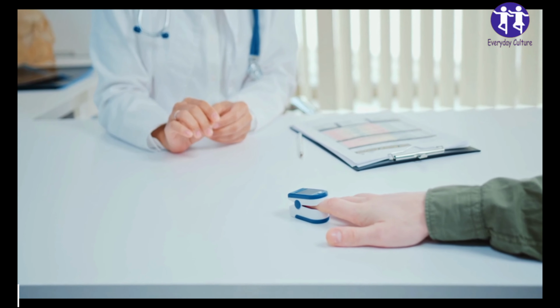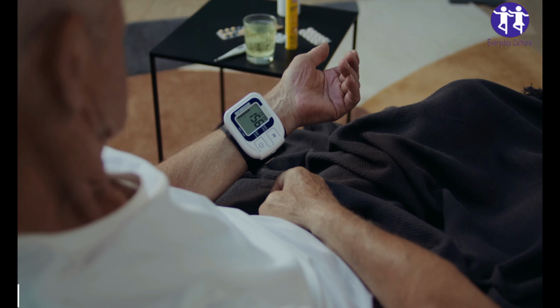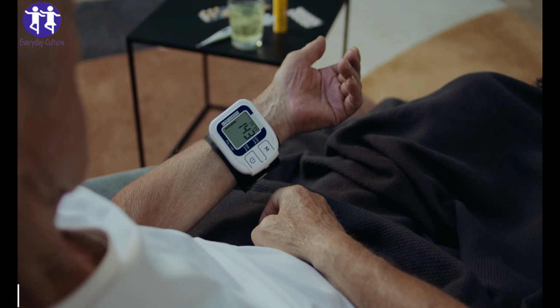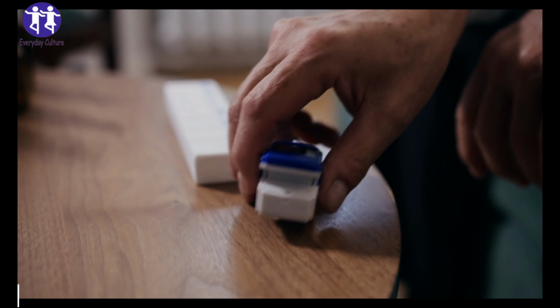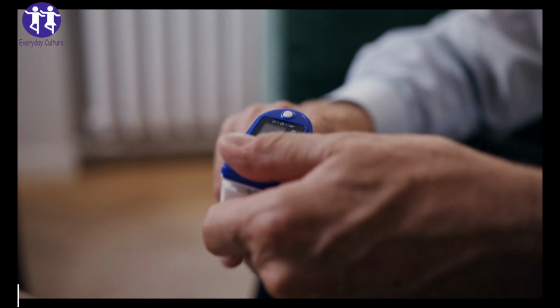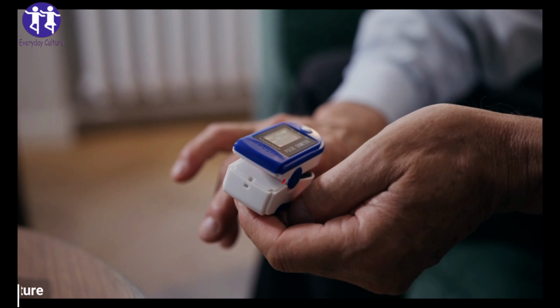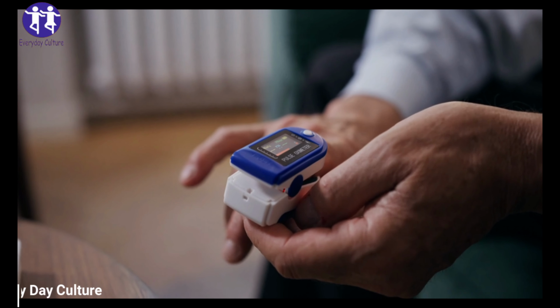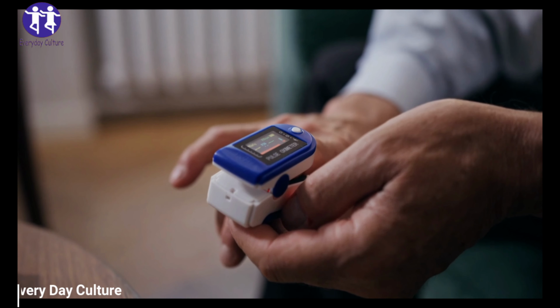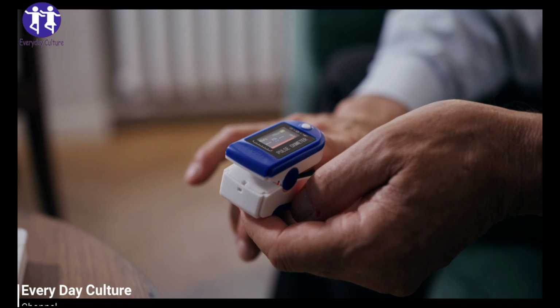This scientific principle can be seen in practice, with arterial well-oxygenated blood appearing bright red due to the fact that it scatters more red light than deoxyhemoglobin. And similarly, deoxygenated venous blood appears much darker because it absorbs more red light. It's a fortunate scientific coincidence that hemoglobin has these properties, because red and near-infrared light penetrates the skin and soft tissue much better than other forms of electromagnetic radiation of around the same wavelength. Pulse oximeters exploit this difference in absorption profiles to detect the level of oxygenation within the blood.